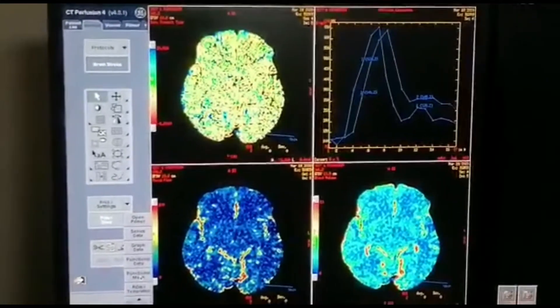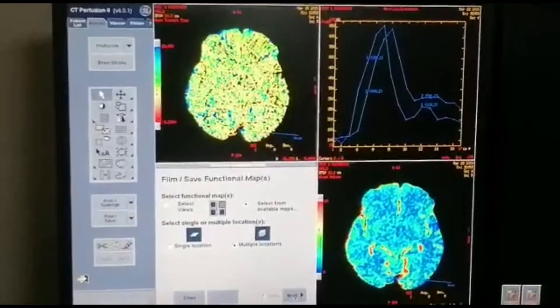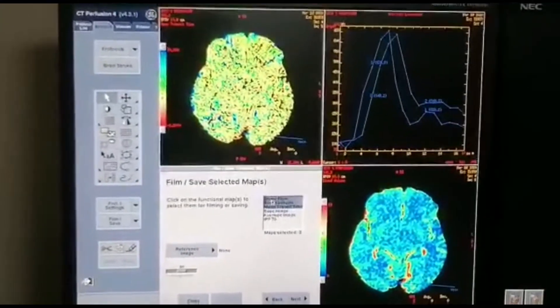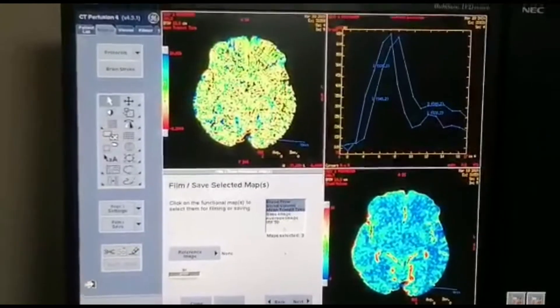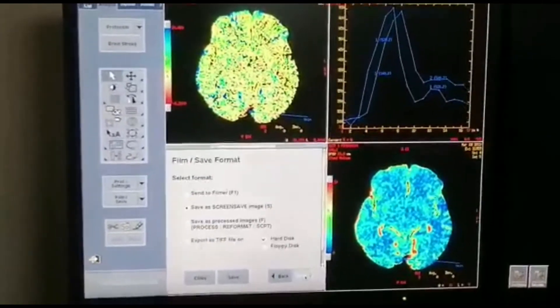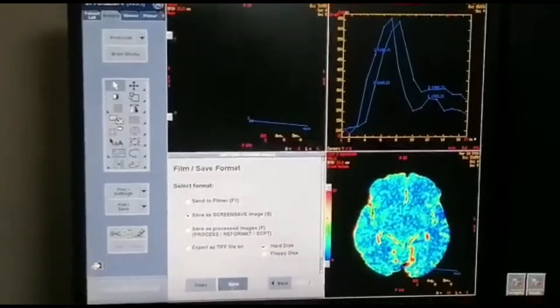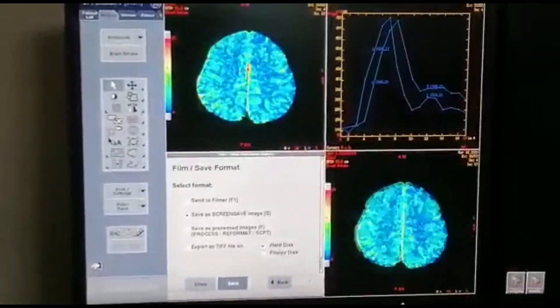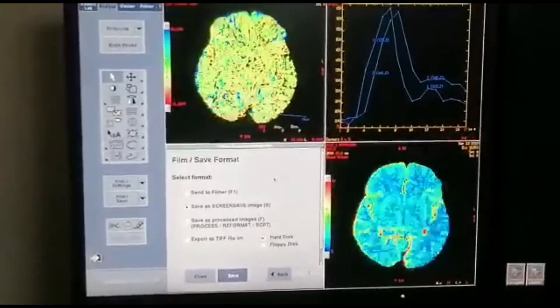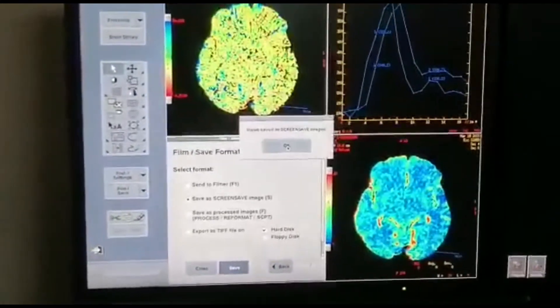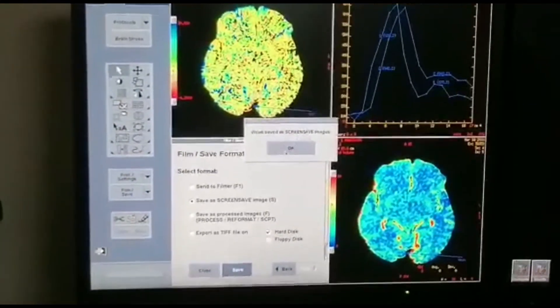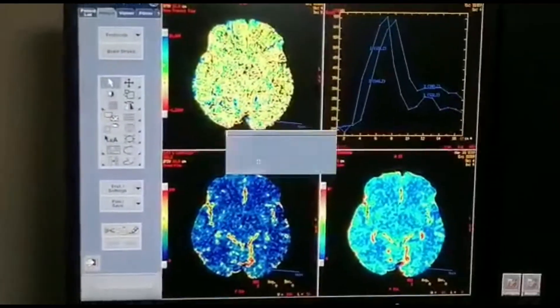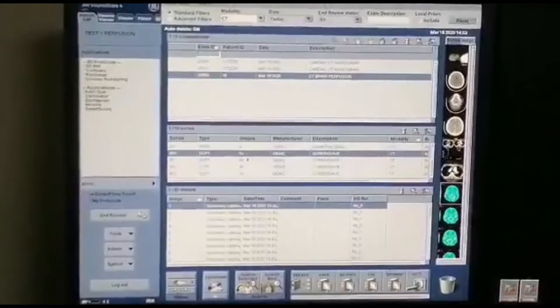Then one by one — and then how is this one — and save functional maps. Make sure you select and lock low blood volume, and then go next. Then save — save all the maps. Close, close, close from here, and this is your functional map.